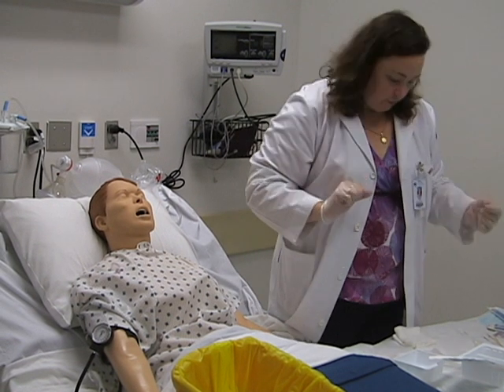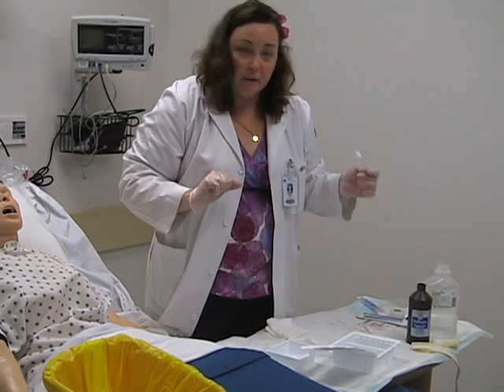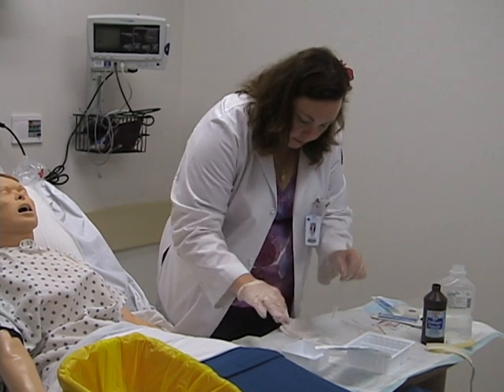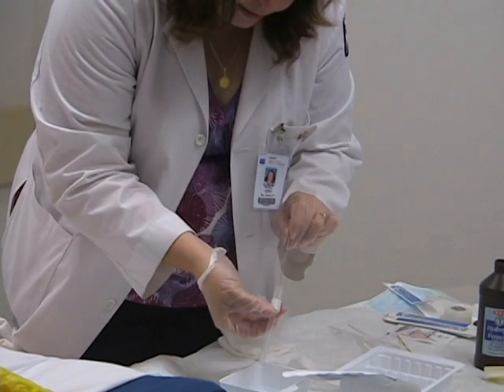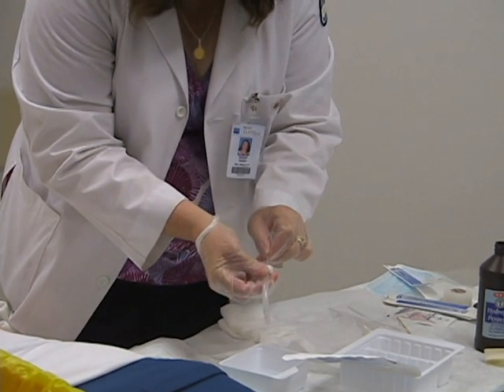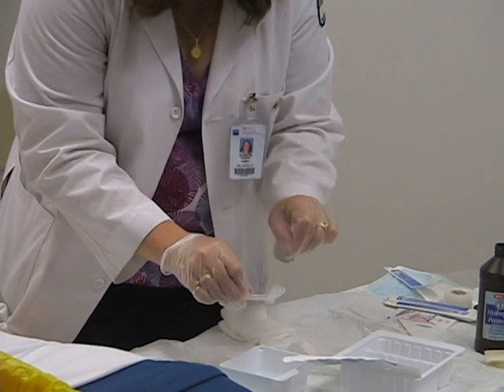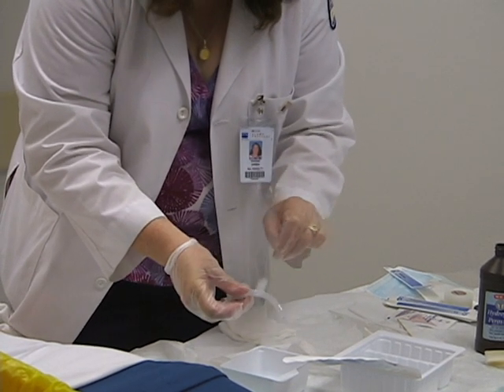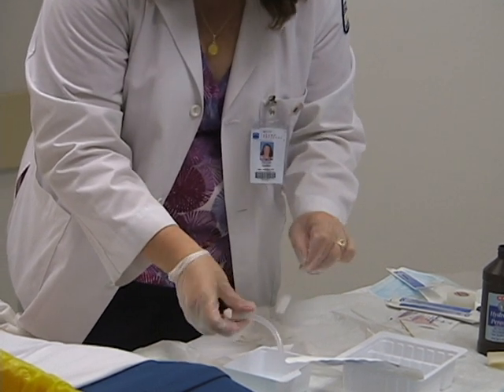Our cannula has been soaking for a little while. Using the bottle brush, we're going to pick up the cannula and scrub it out. You can use the brush on the outside as well. When you take the cannula out, note the amount of secretions, the color, and consistency.